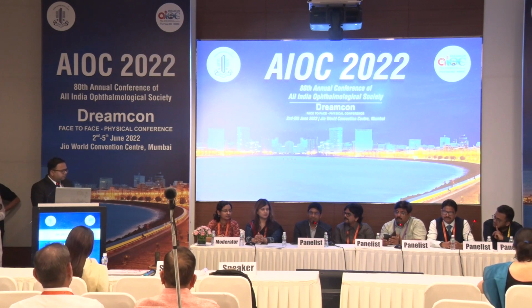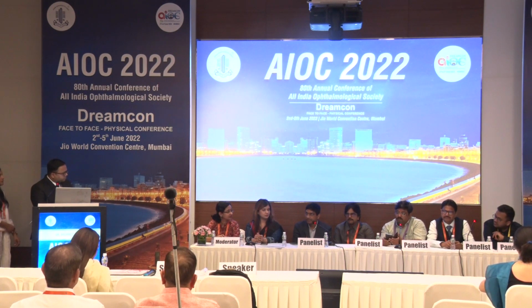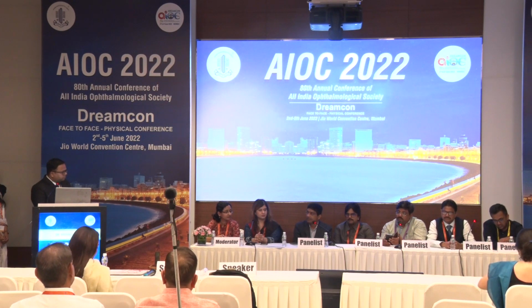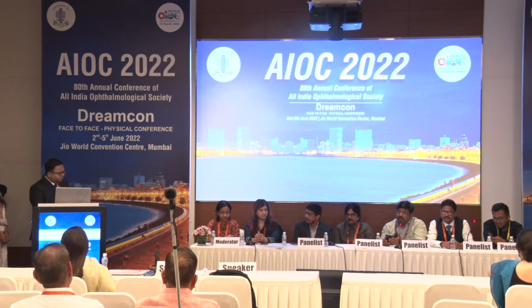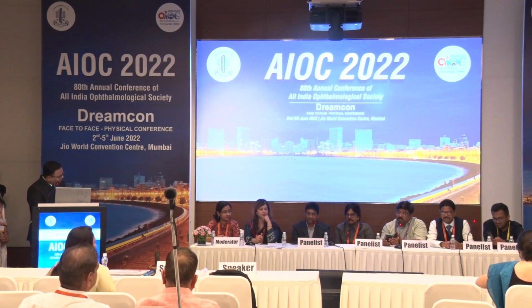Nowadays we don't require a 180-degree inferior retinectomy in the presence of anti-VEGFs, TPA and SF6 gas; all this can be tried first. Otherwise, this surgery itself is more traumatic. This is a massive hemorrhage, subretinal as well as sub-RPE, and the surgical trauma is more than it would have been if managed without it, and you get equally good results. That can be tried in the future. Yes, thank you very much. Thank you, sir.